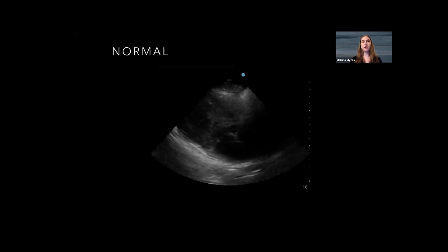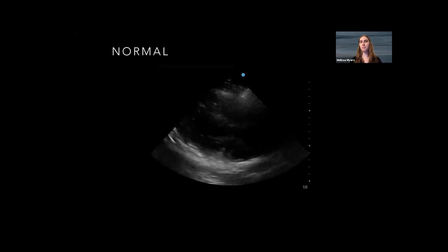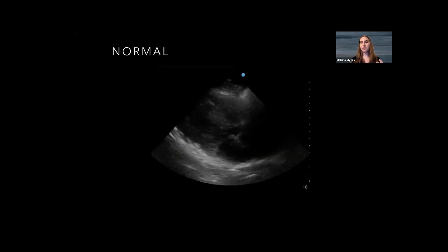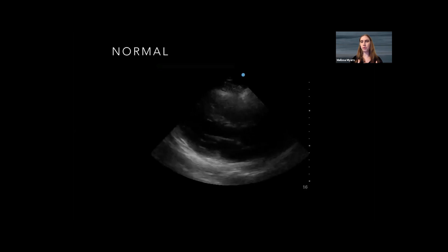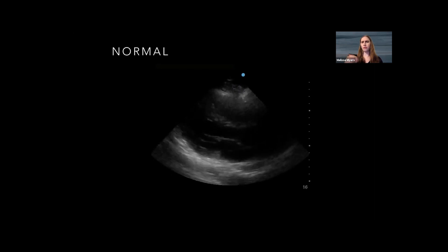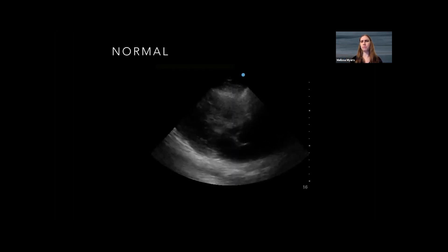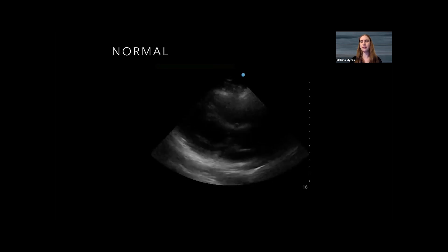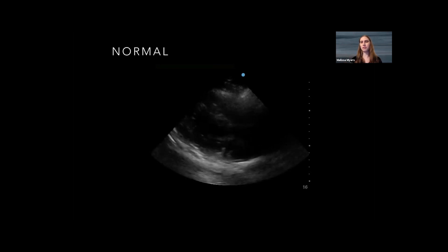The second question is always how. I'm going to take you through three commonly performed point-of-care echocardiogram views that you're already using, and we're going to talk about looking for right heart dysfunction on those views. Let's start with the parasternal long axis — kind of the bread and butter of the point-of-care echocardiogram. This is the view where we have our ultrasound probe placed right about where the V2 sticker goes, pointing that indicator at the right shoulder if we're in cardiac mode. We should see something that looks roughly like this.